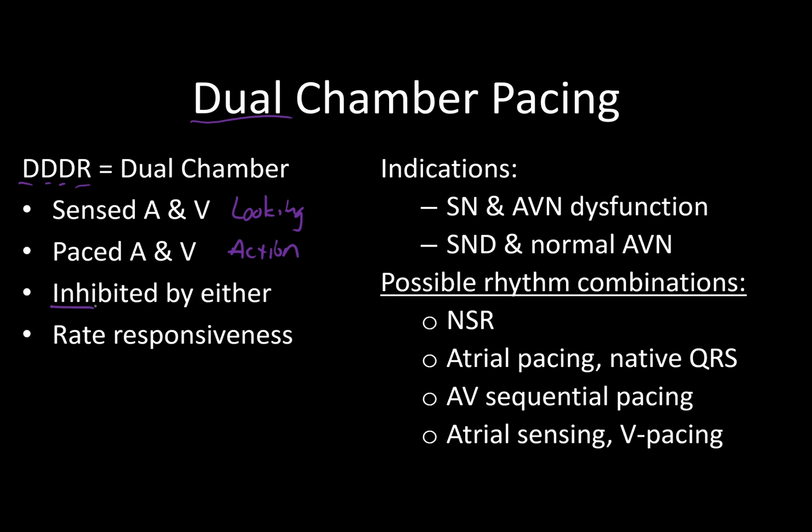It can be inhibited by either, and that gets a little complicated. I'll come to that in a second. And I added the R on here because that puts a little bit of rate responsiveness on there too, which is just another feature that can be on there. This winds up being your Bentley, your Rolls-Royce kind of pacemaker. If you want to, you can think of it as the latest version of your iPhone, Samsung, whatever, with the latest watch included. It has everything you could possibly hope for. All the bells and whistles.